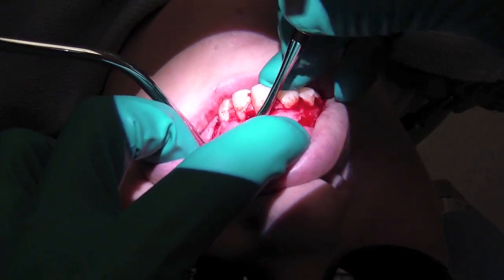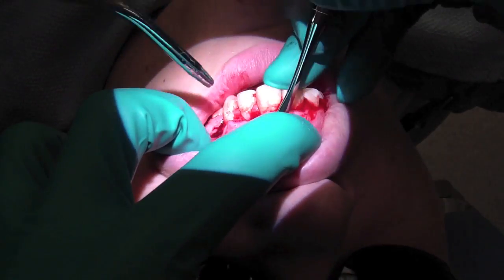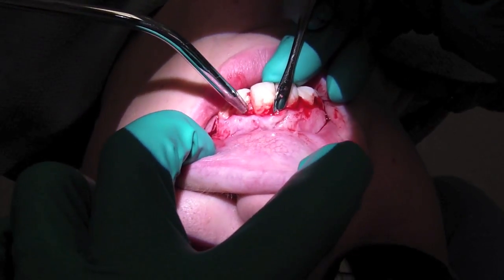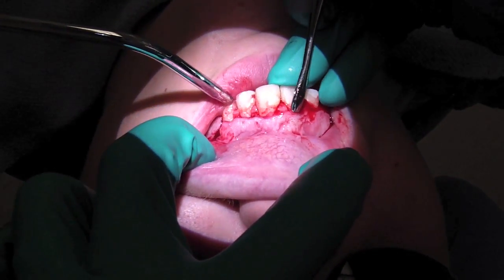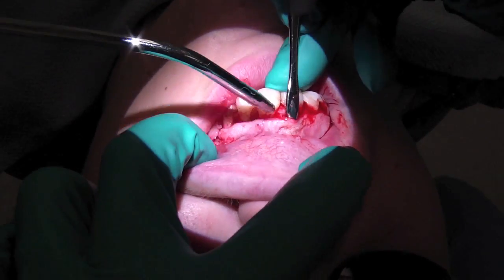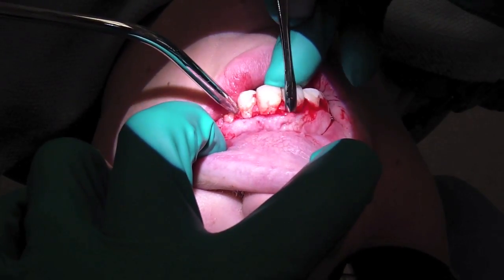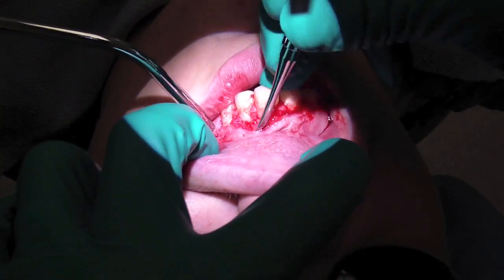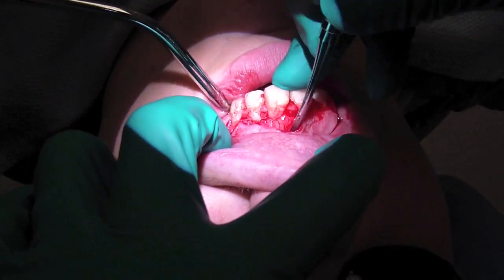Making your flap elevation much easier. Here I'm just using a periosteal elevator. Things I'm looking for: any dehiscence or fenestration on the root in question, which is tooth number 10, or FDI 2-2. Making sure I'm getting sharp dissection, getting right down to the bone, getting that periosteum off the bone.